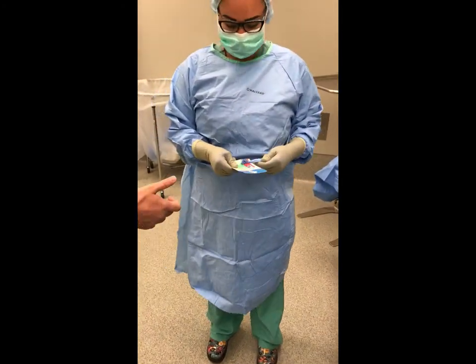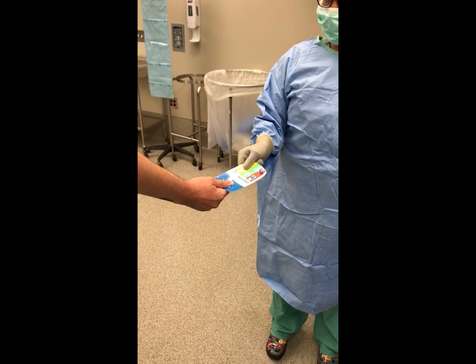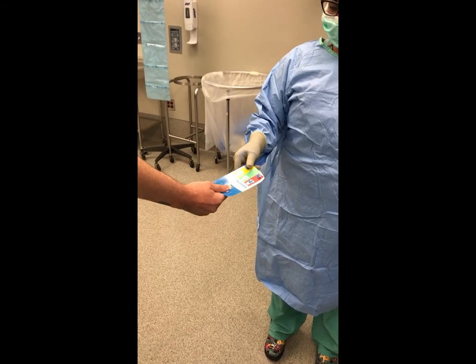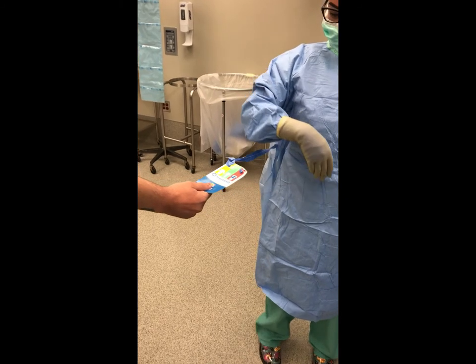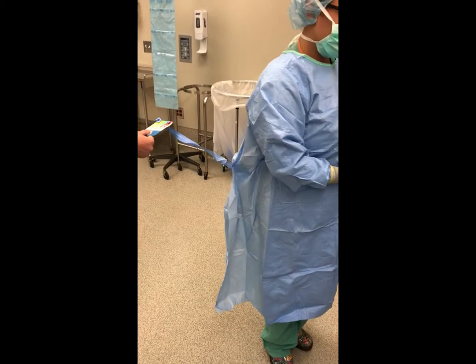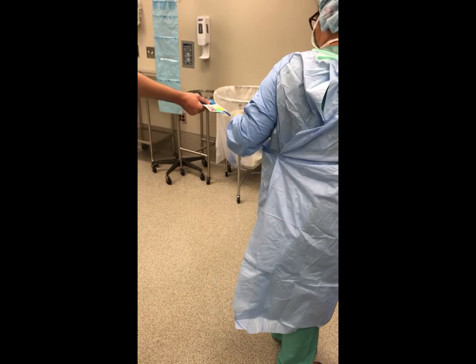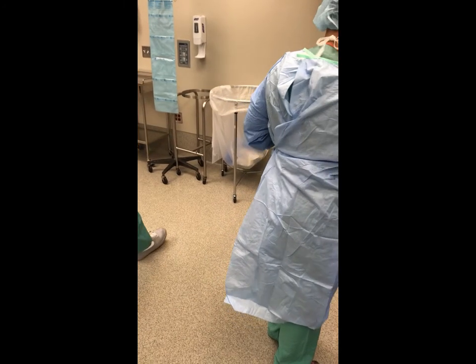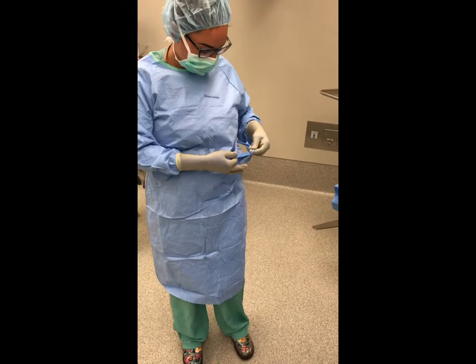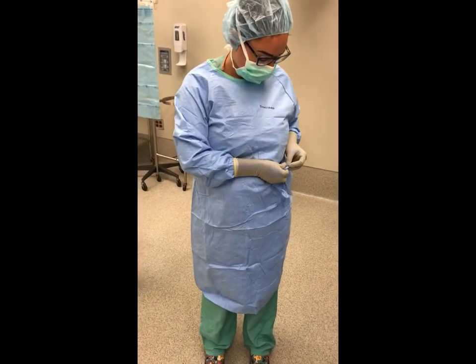After gloves are on, the scrub person hands the cardboard tab attached to one of the gown's ties to the circulating nurse. The circulating nurse takes hold of the tab without contaminating the scrub person's glove, and holds it while the scrub person makes a three-quarter turn, causing the gown to wrap around the body and cover the inner waist ties. The scrub person then pulls the belt so the tab is freed and remains in the hand of the circulating nurse, then ties the two ends of the belt.